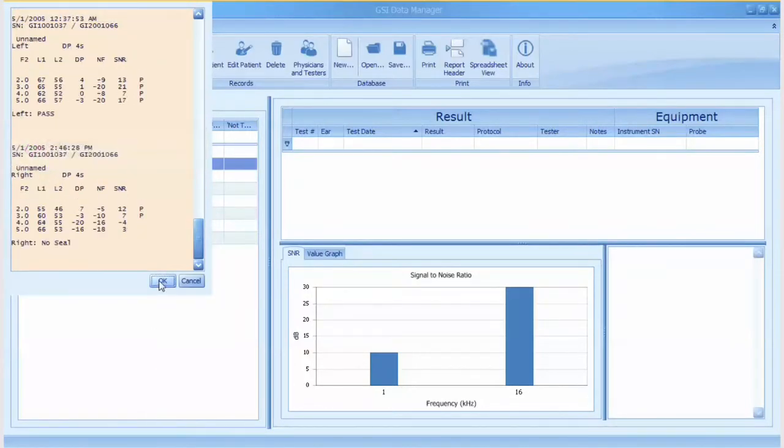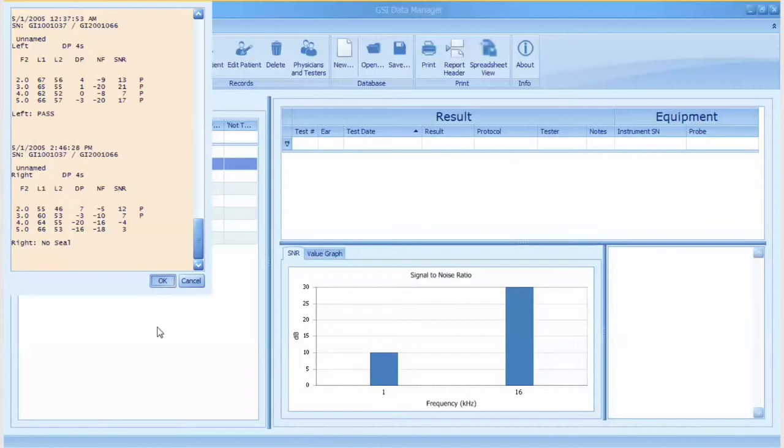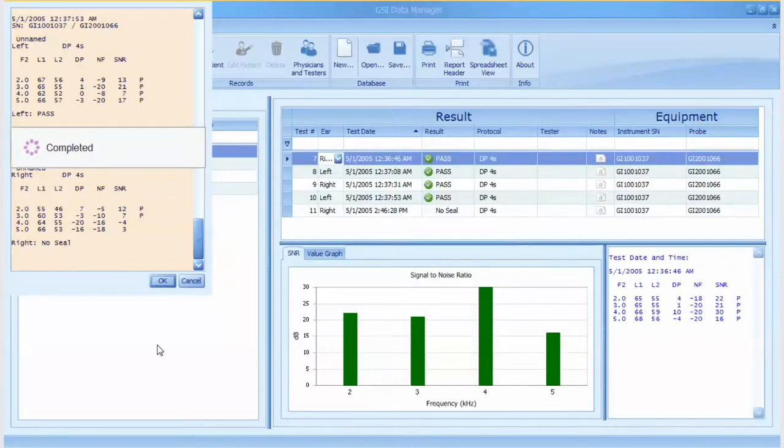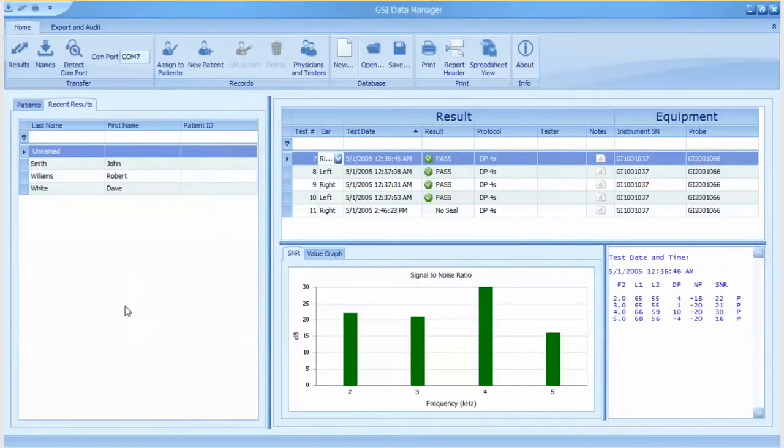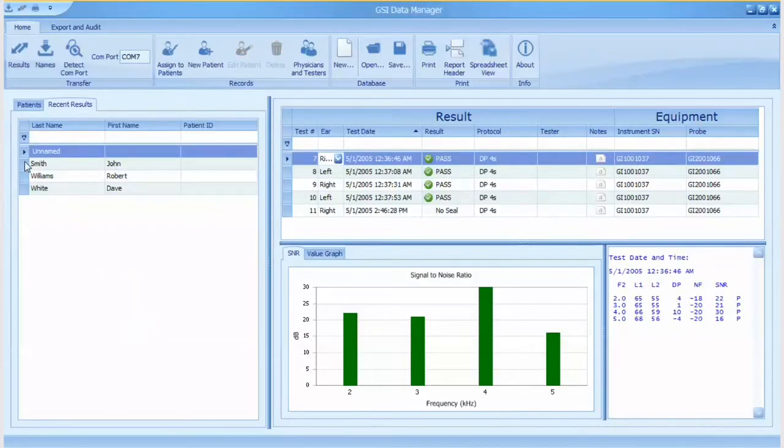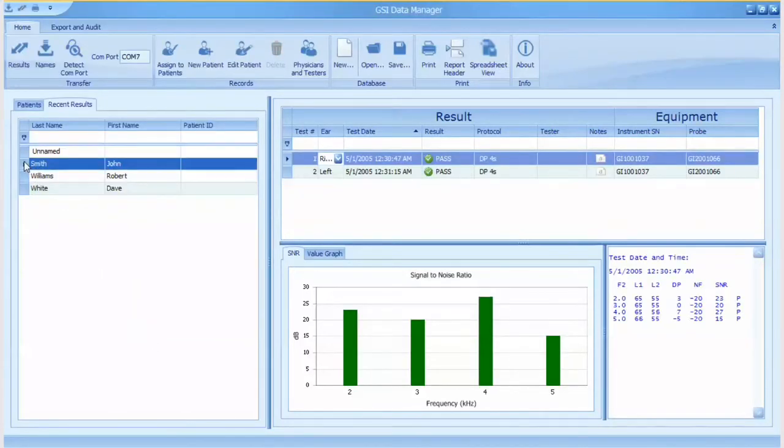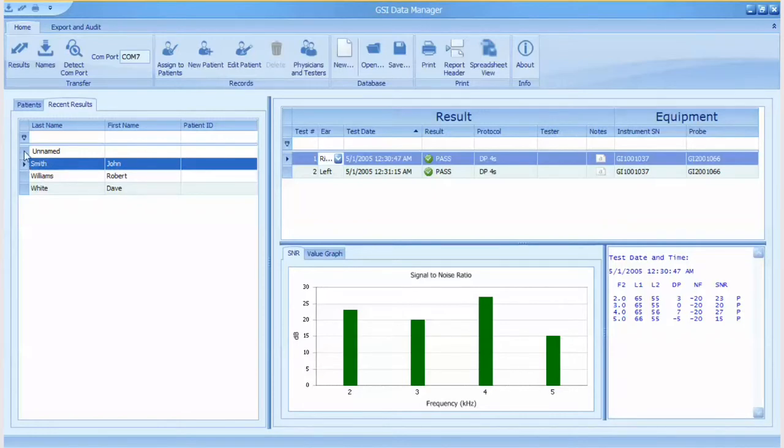OAE tests associated with names will transfer to the appropriate patients. OAE tests not associated with a patient name will be transferred to the unnamed patient location. In this example, five tests were completed using the unnamed patient.